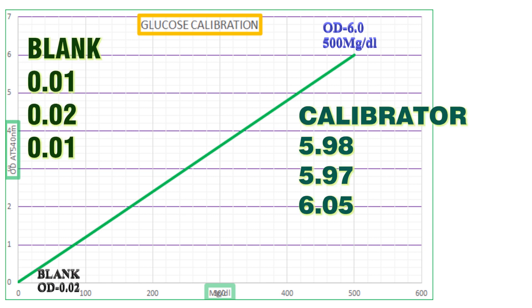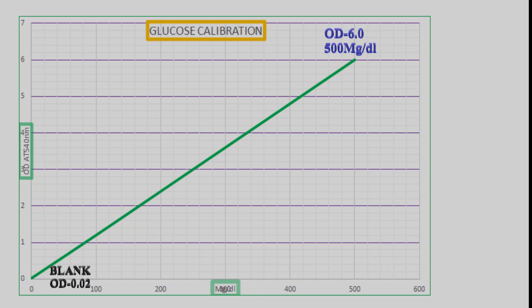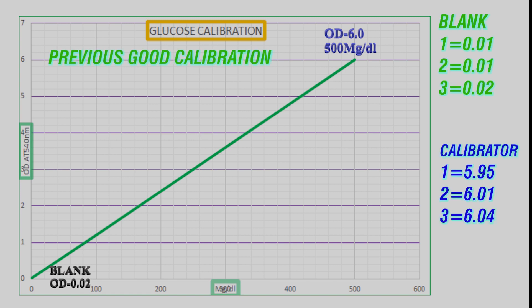Always take a printout of a good calibration curve when all your QCs are in range. This will be very helpful when we have issues with calibration. Whenever there is a calibration failure or QC failure, take out the previous good calibration curve and compare it with the new one to check the difference. For example, if we are getting different values in all three readings, the instrument cannot produce the same value across all three runs — this is like getting three different glucose results from the same sample.